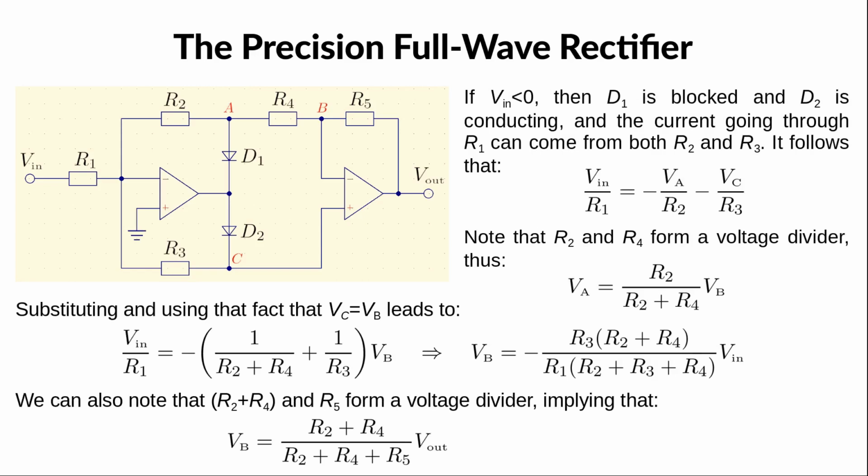Now, if Vin is negative, then the output of the first op-amp must be positive, as it is the only way to keep the inverting input virtually grounded. Thus, D1 is blocked and D2 is conducting. In this case, the current that flows through R1 can come from both R2 and R3. The equality of the currents coming and leaving the node at the inverting input is then expressed as Vin over R1 equals minus Va over R2 minus Vc over R3. We can use here the fact that R2 and R4 form a voltage divider, so that Va is equal to R2 over R2 plus R4 times Vb. If we substitute this expression into the first equation and use the fact that Vc equals Vb, we obtain an equation that involves only the input potential Vin and the unknown potential Vb. So we can solve for Vb and express it as a function of Vin.